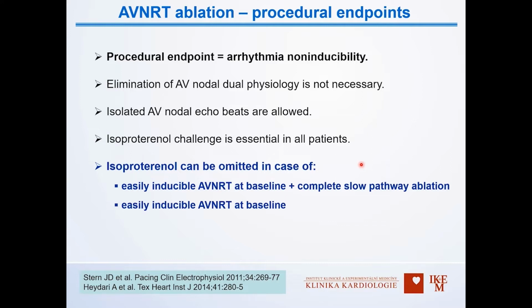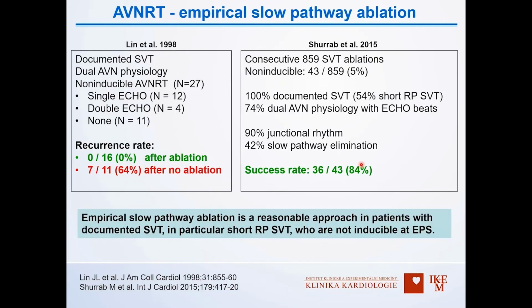On the other hand, isoprenaline challenge is essential in all patients, even if there are some studies that indicate that isoprenaline can be omitted in case of easily inducible AVNRT at baseline. It means without isoprenaline, or the same criterion combined with complete slow pathway ablation during the procedure.